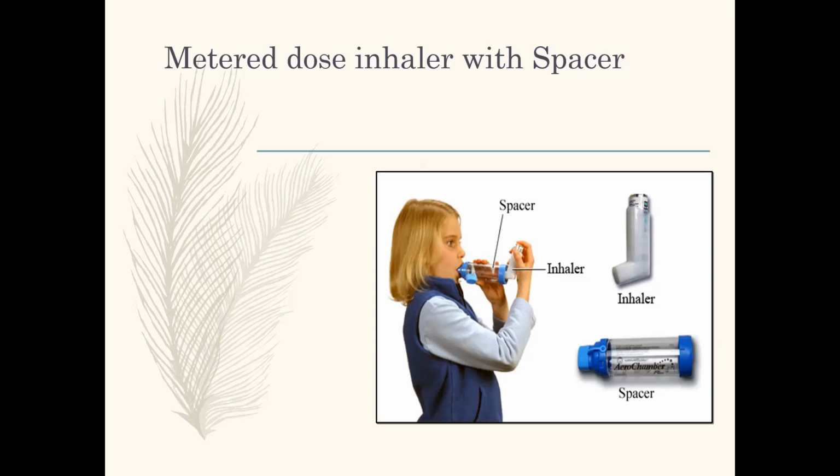We want them to wait 1 minute and repeat the dose if 2 puffs are prescribed. So if it's just 1 puff, they're done. If it's 2 puffs, they need to wait a minute before they do their second puff. They need to put the mouthpiece back on and clean anything as directed. And if they're using certain types of medication, they would want to rinse their mouth with water and make sure that they spit out the water afterwards.